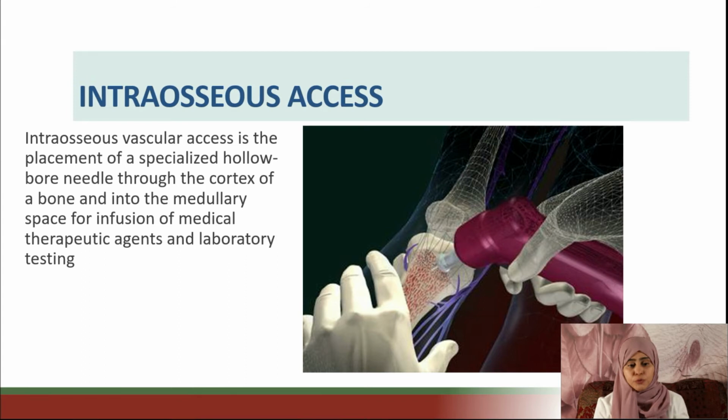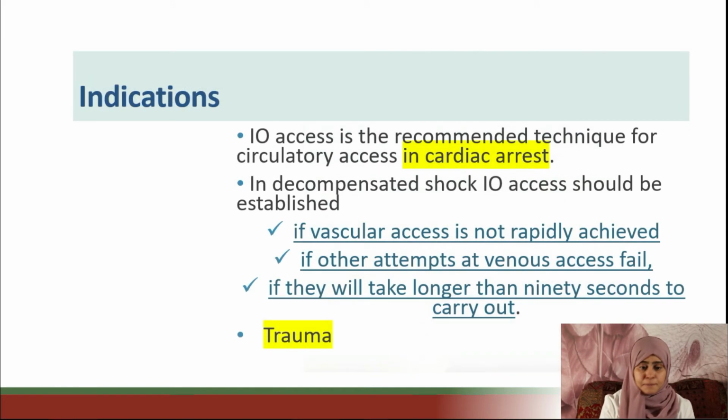Now, we will move to the intraosseous access. What is intraosseous access? It is the placement of a specialized, rigid, hollow bore needle through the cortex of the bone and into the medullary space for infusion of medical therapeutic agents and also for laboratory testing.